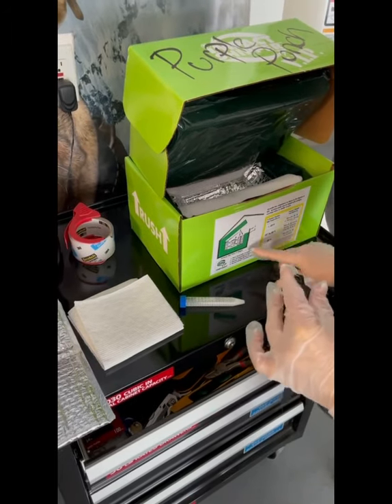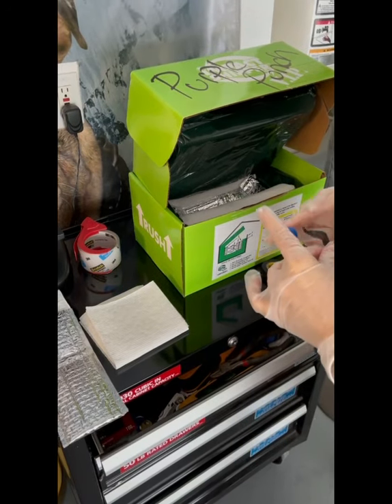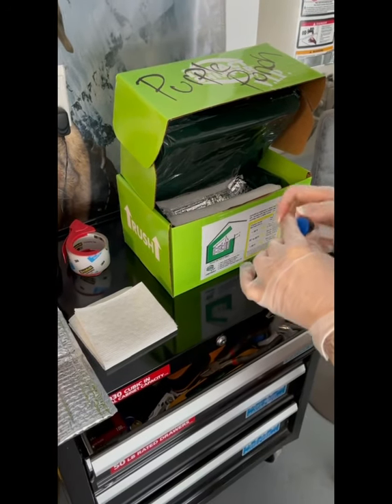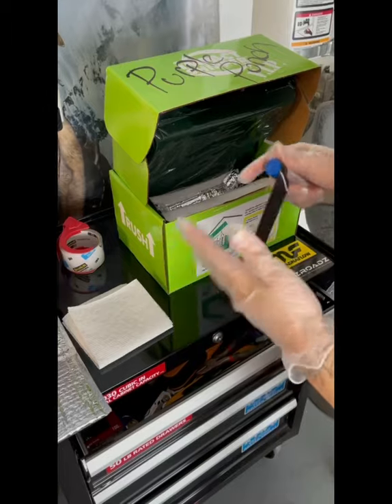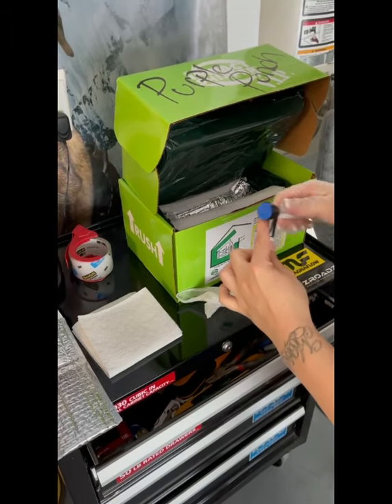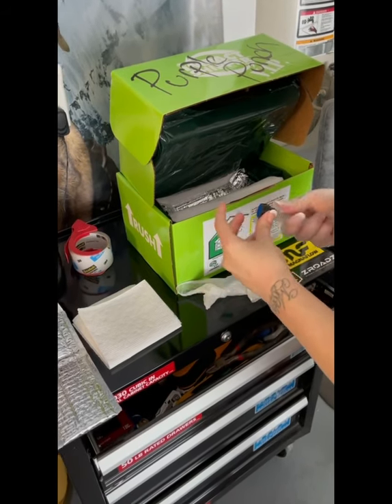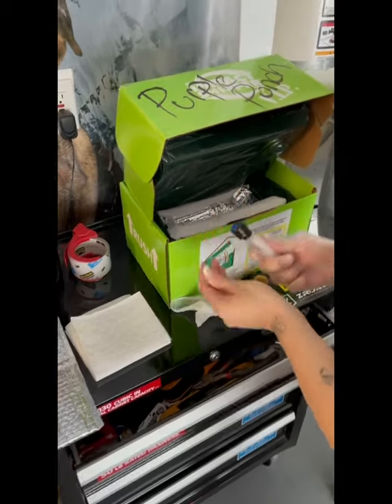Let's get this packaged up and ready to go. We're taking the electrical tape and we're going to seal the vial, so that when it's on its way to its destination there's no leakage.